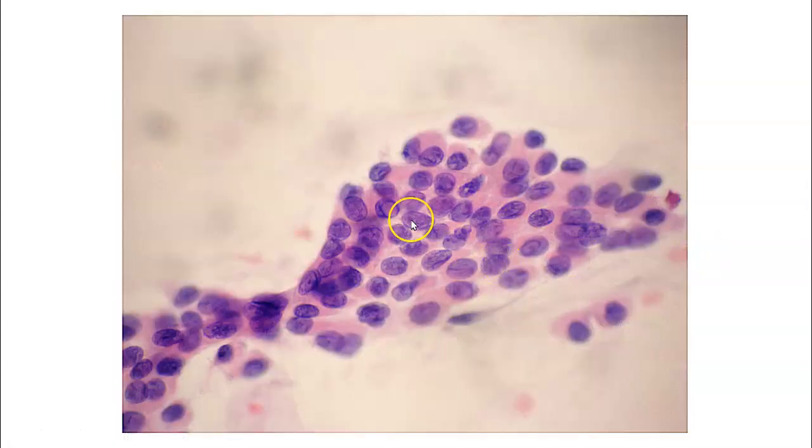Now here is an example of an intraoperative smear, and this is an H&E stain. I often do this for frozen sections of the thyroid gland because you can see the true nuclear features much more readily and more accurately compared to a frozen section, where you can have a lot of artifacts that can give rise to pseudo-inclusions. So true inclusion here. And I think H&E stain is fine. You don't have to have a Pap stain.